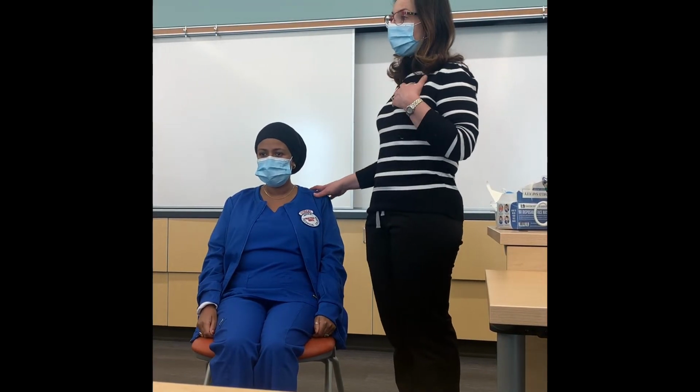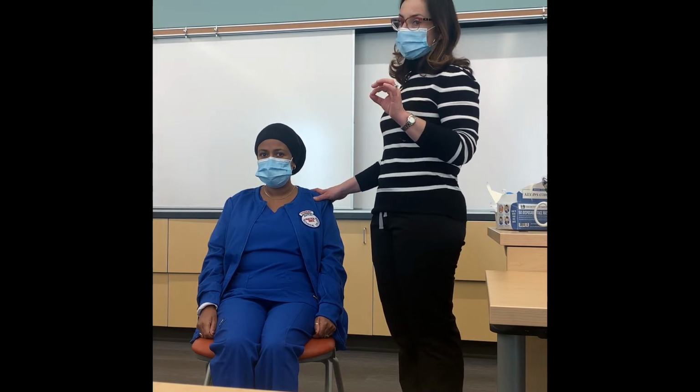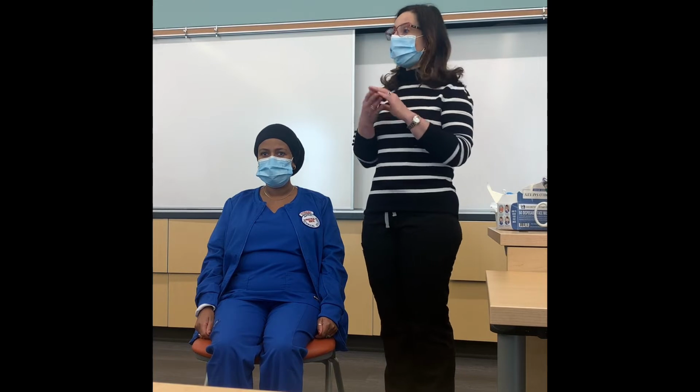Best way to do an assessment is on skin. So you guys, whenever you are listening to a patient's lungs, you have to put your stethoscope directly on the patient's skin. Now tell me why. Because you can get movement from clothes and things. Yes, exactly. So whenever you are listening to the lungs, think about what the stethoscope is designed for, right?